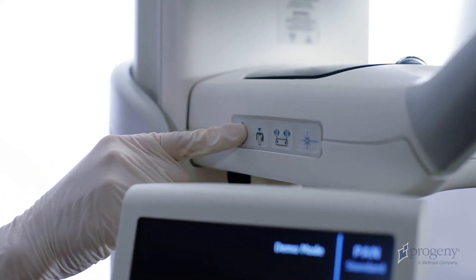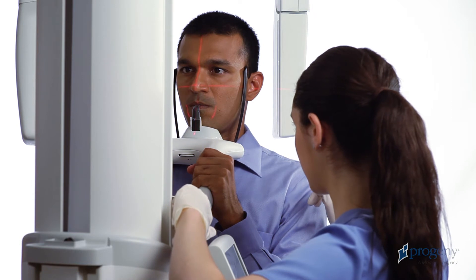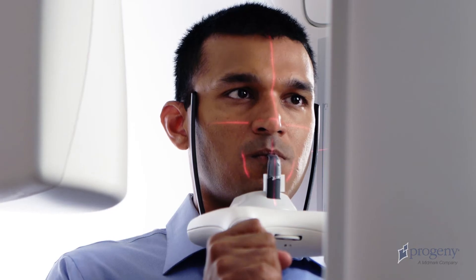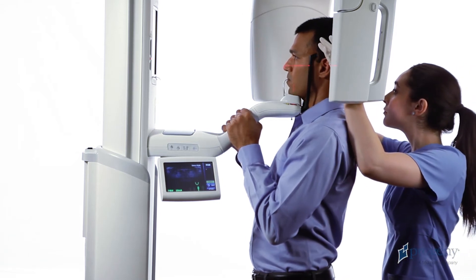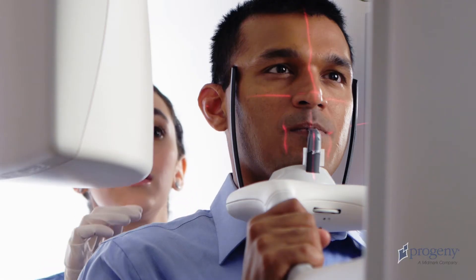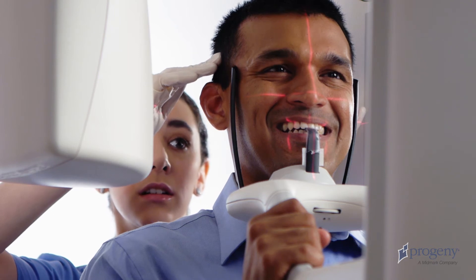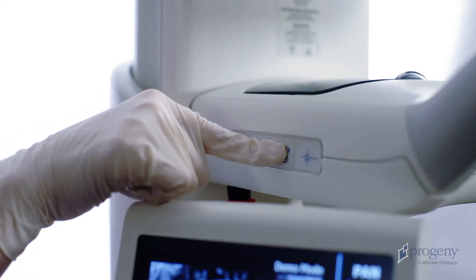Use the height of the positioning table to tilt the patient's chin higher or lower, bringing the Frankfurt plane horizontal. Move directly behind the patient and gently rotate their head to align with the projected mid-sagittal laser. Be sure to observe alignment from front to back as well as from top to bottom. Close the head support wands.